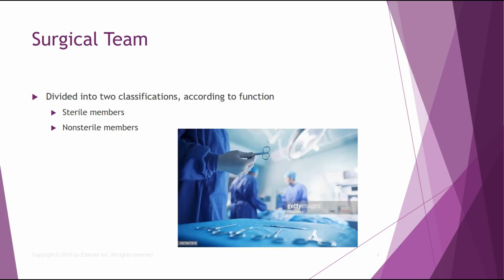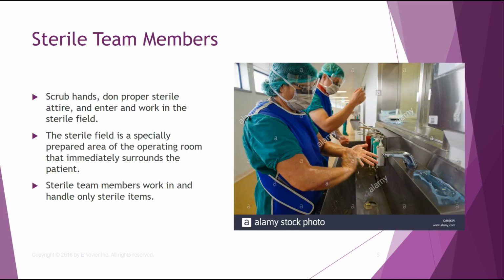Okay, they're divided into two classifications. You'll need to know this: sterile and non-sterile members. Sterile team members all have to scrub in. Very important if you're the radiographer that's going to be doing a case there, that you make sure your surgeons are putting their lead on before they scrub in. And they're usually good about it because they have their own lead that they carry around.